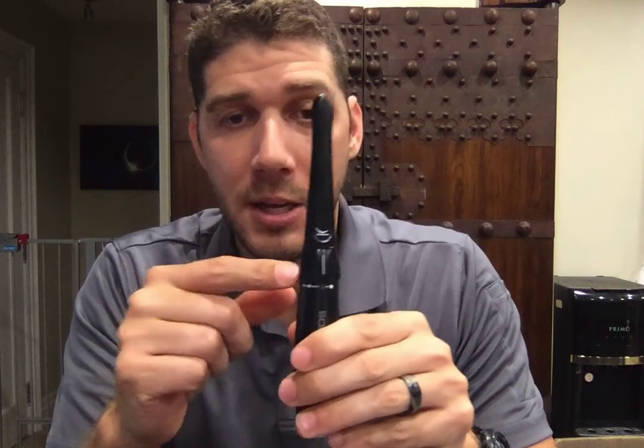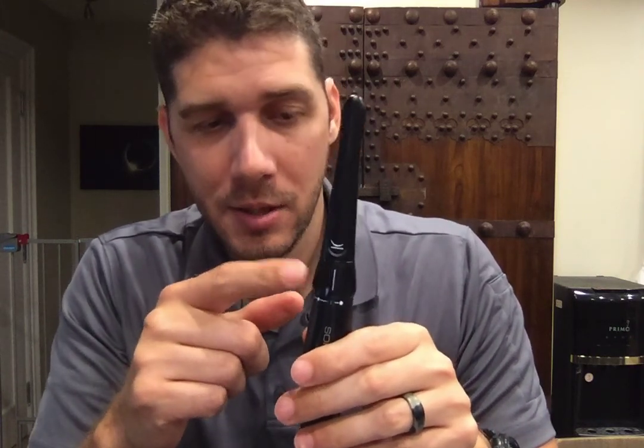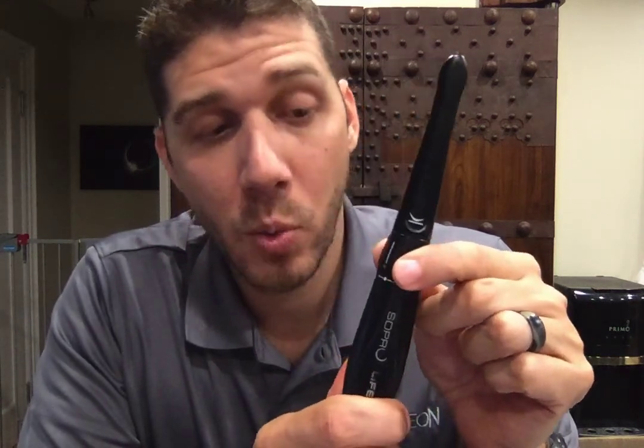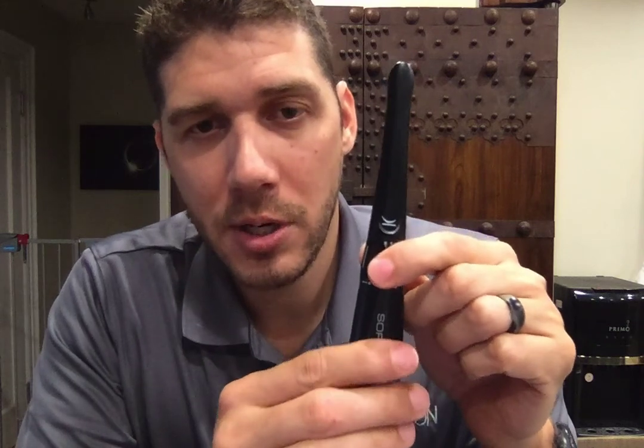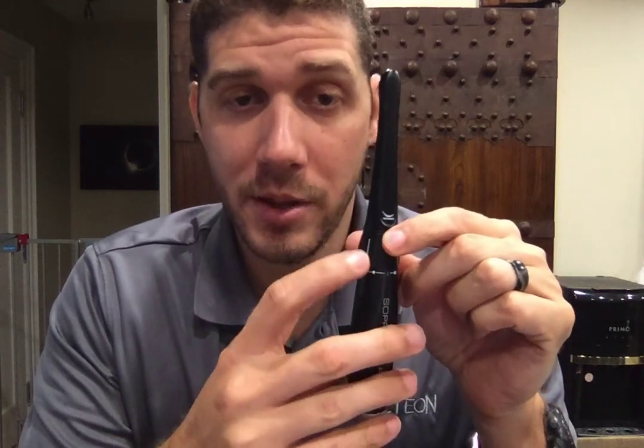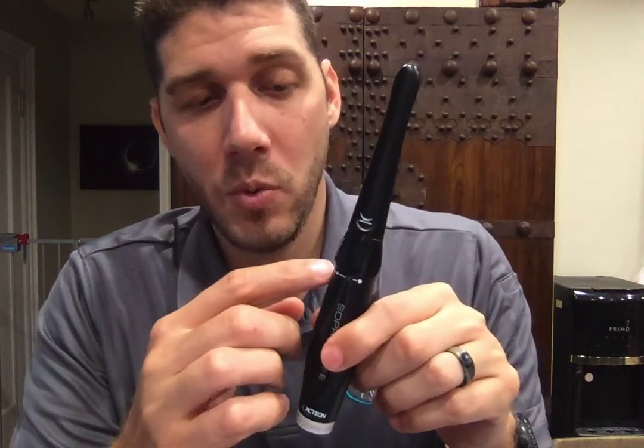Moving down, this is our focal ring — this is where a lot of the magic is. You'll notice there are a series of dots on here, from a big dot all the way down to a little dot. This adjusts the focal length of the camera, meaning certain things will be in focus and certain things will be out of focus depending on where this dot lines up. For example, if you wanted to do a face photo, the camera is going to be further away than if you're doing a smile, so you need to change the focal length.